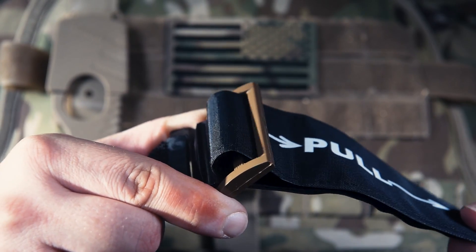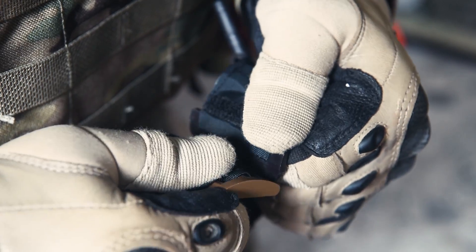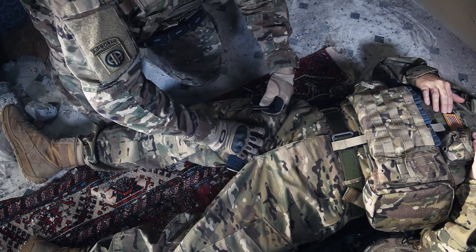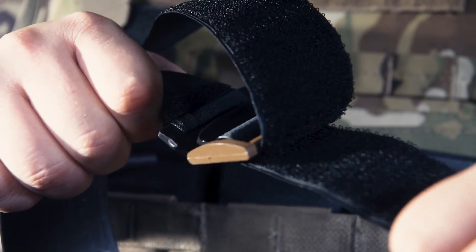The TMT comes pre-routed, eliminating the need to self-route in tactical situations. The ability to separate the speed buckle allows for fast and easy application around an extremity. The TMT's buckle is self-locking, and the Velcro is not integral for life-saving operations.